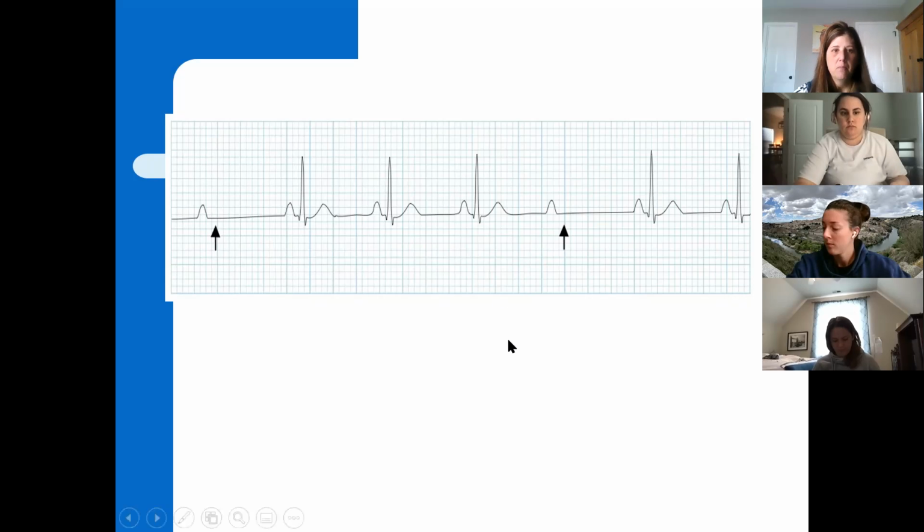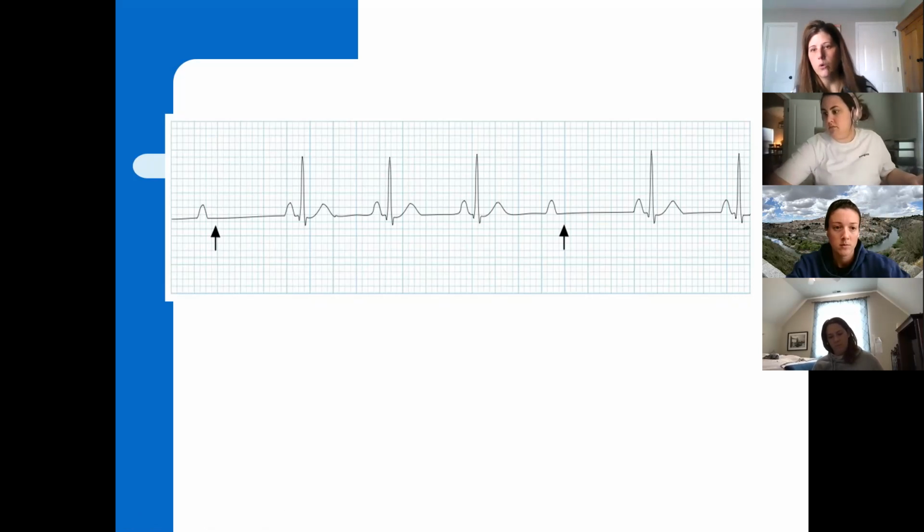Okay. Let's try and get through third degree here. And then after lunch, we'll have to do the dysrhythmias of the ventricles, and we'll have to do a little bit about pacers. And then we'll get into that later in codes and also Dr. Bennett at the end of the semester, but we're going to touch on it today.